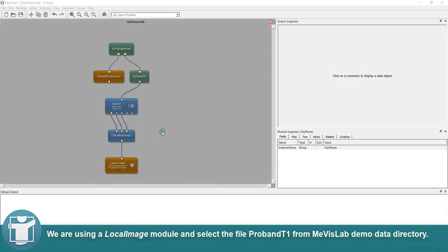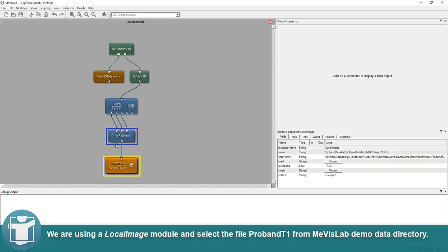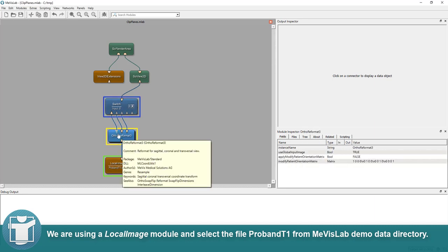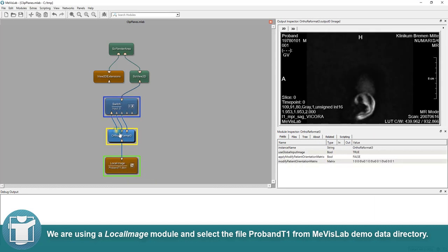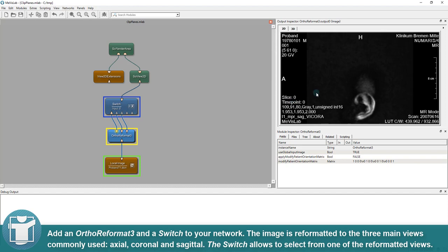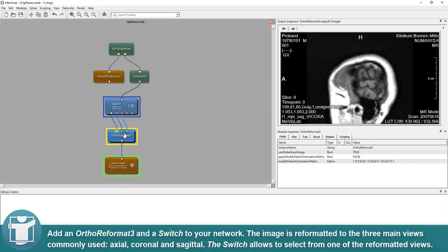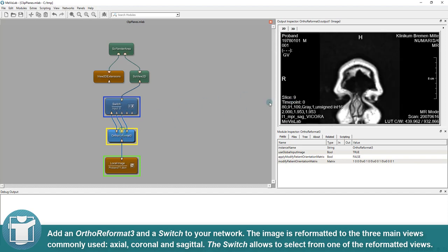We are using a local image module and select the file ProBand T1 from Mevislab demo data directory. Add an ortho reformat 3 and a switch to your network.